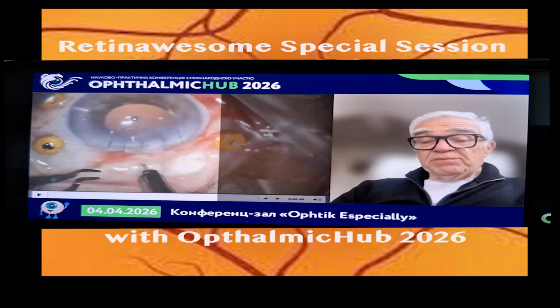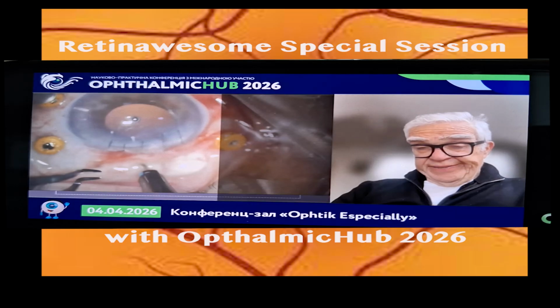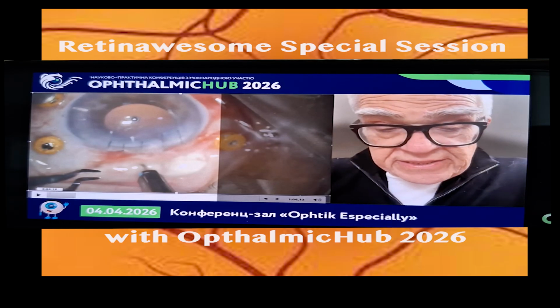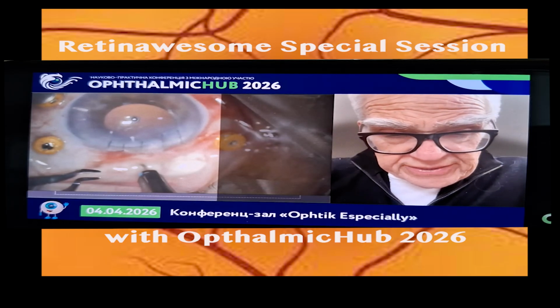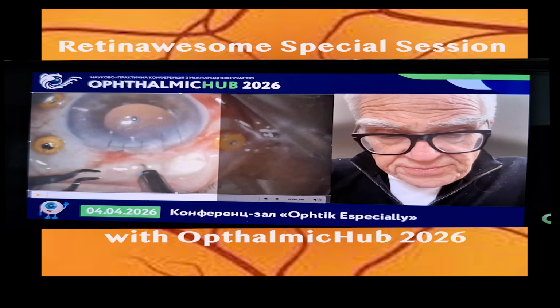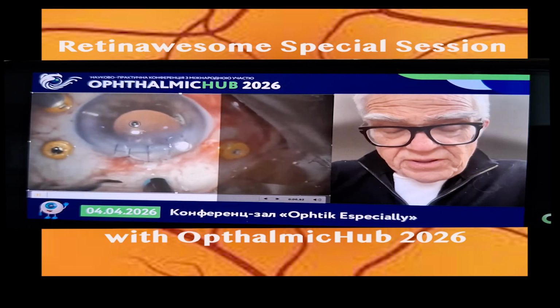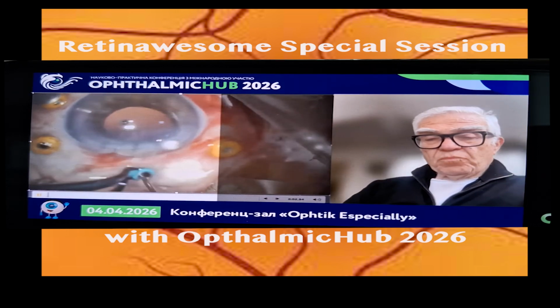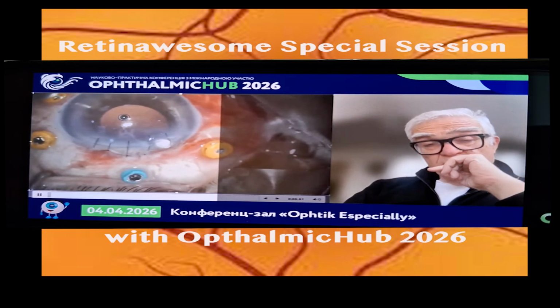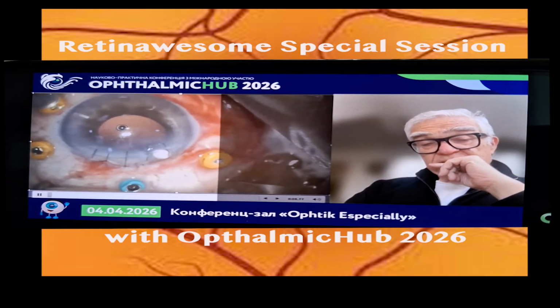So this is an extreme example of how things can go wrong when the patient is fishing. Sorry, it doesn't actually go. There it is. You see, we have a patient, we have a nucleus gone in, and somebody told us to fix it.